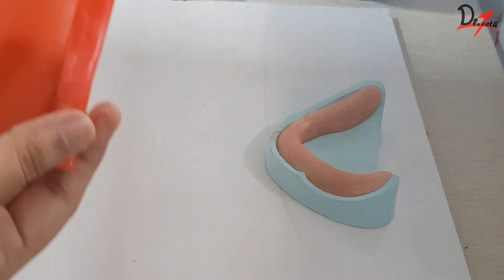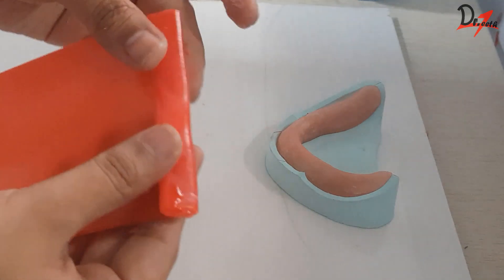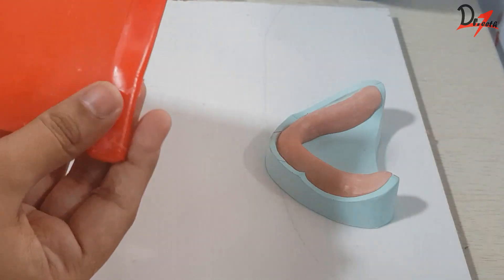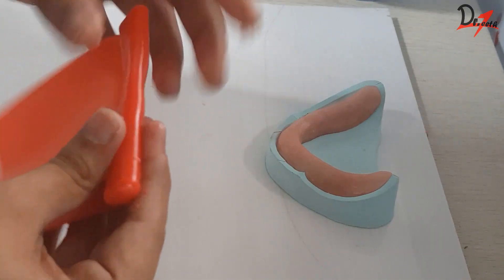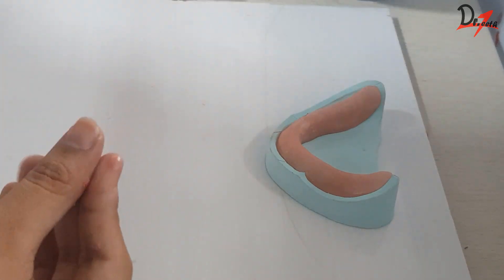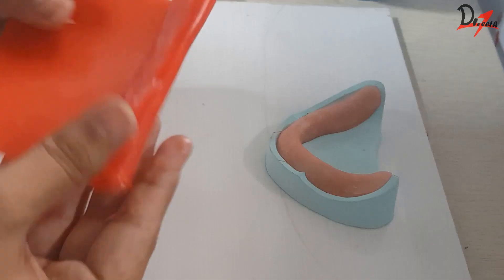What I'm doing here is I am taking a wax sheet — modeling wax — and I'm heating it properly and rolling it as you can see here. We will give a good amount of heat so that it starts dripping a bit and then we will fold it. Make sure that you heat it properly so that there is no air entrapment in between.